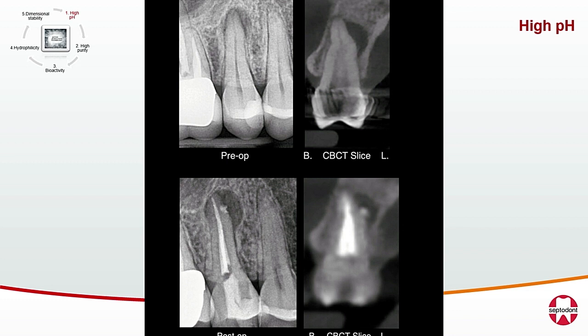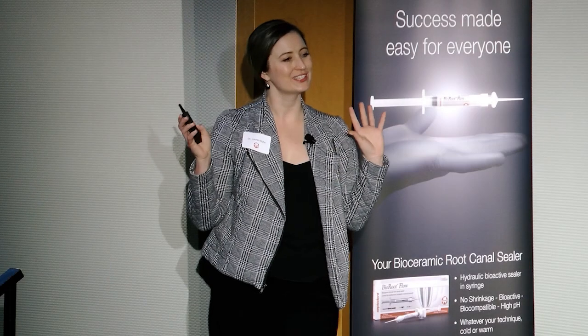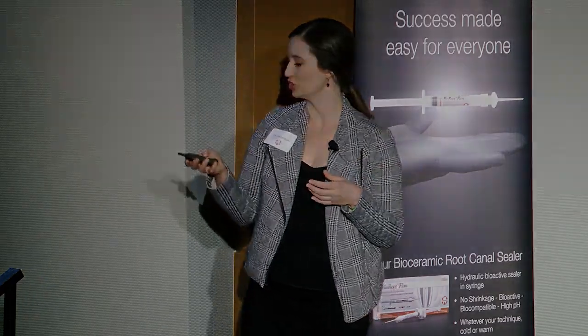And when I finished, I got this little puff and I took a lower resolution post-op cone beam to try to minimize radiation to the patient, but confirm my obturation, which then helped me determine when I was going to recall the patient and let me know the likelihood of whether she may or may not need an apico later. Essentially, my BioRoot Flow did go where I wanted it to, and I know the fact that it's sealing this, it's going to stay sealed, and it's going to kill bacteria as well because of that high pH.